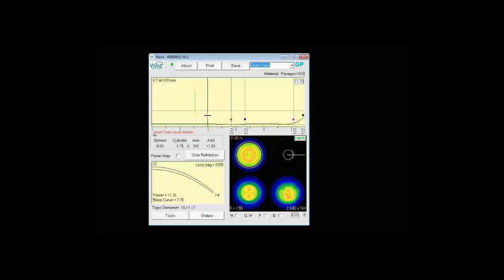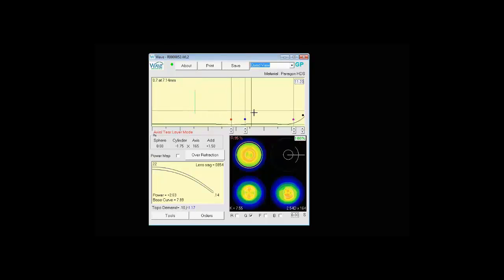As you click down here it shows you the amount of clearance. On this particular design it's showing us that we have less than 1 micron of clearance all the way across. So what this will actually give you on the eye is a lens that is very well aligned. It's going to be floating on a layer of tear. It's going to be a very comfortable and very stable lens design.